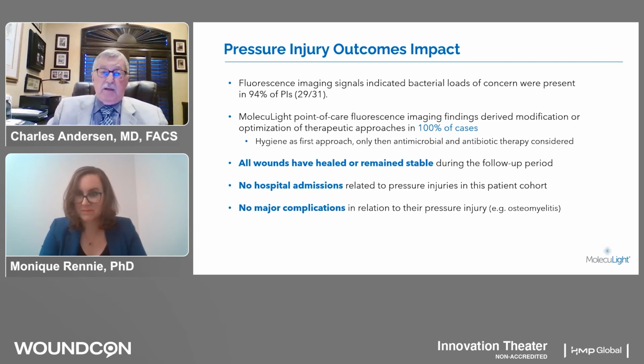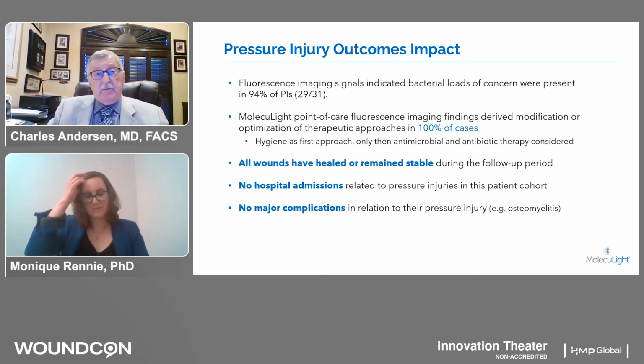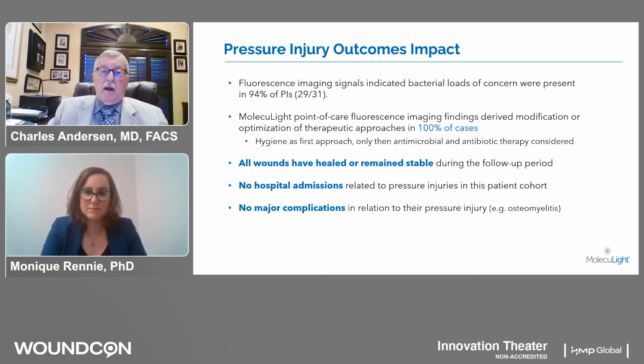Thank you, Monique. We were very surprised in what we found with scanning of pressure injuries. In this review, 94% of our patients scanned with pressure injuries had evidence of bacteria. By early identification and treatment of this bacteria with cleansing, debridement, on occasion, a short course of antibiotics, none of these patients progressed on to requiring IV antibiotics. None of the patients required hospitalization, and these patients went on to heal or are in the pathway for healing. So excellent outcomes. Again, early identification, early treating, preventing major complications in pressure injuries.